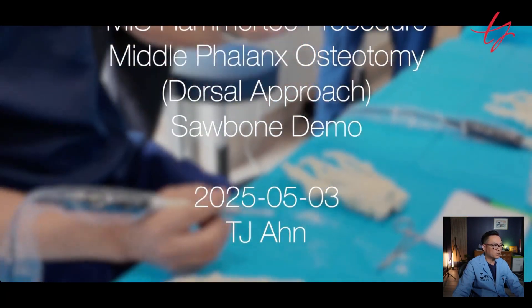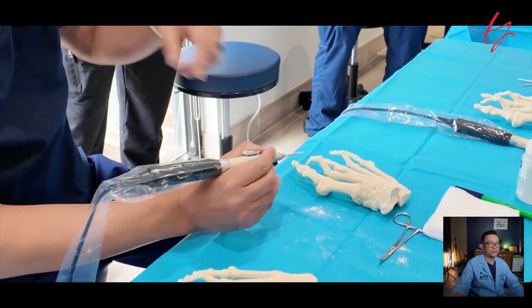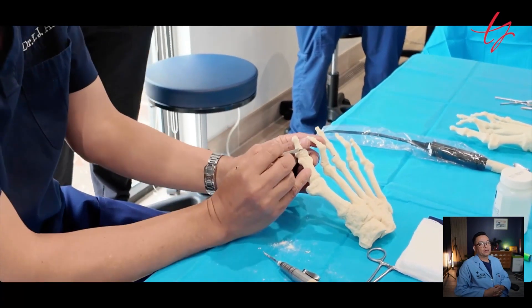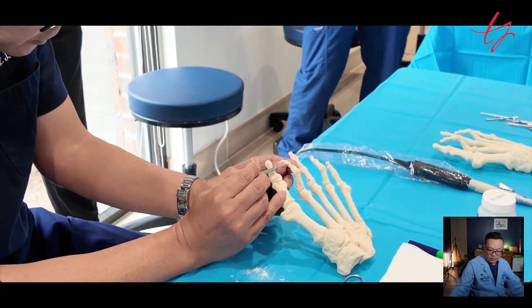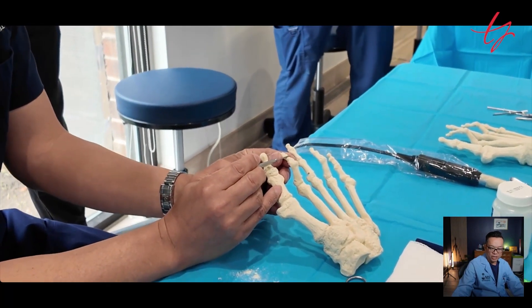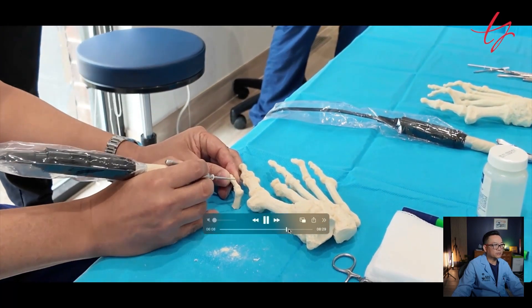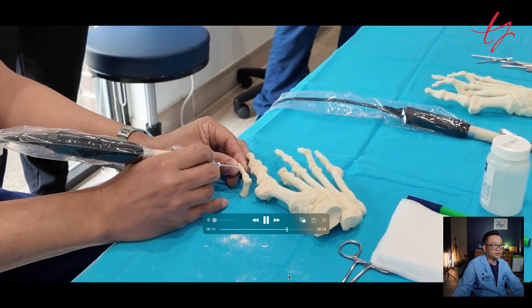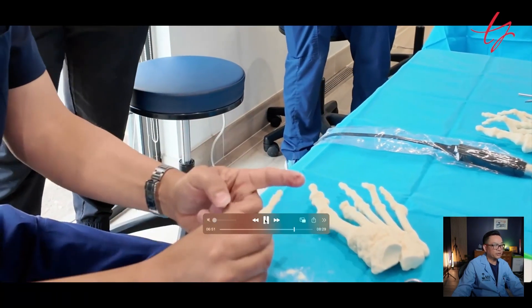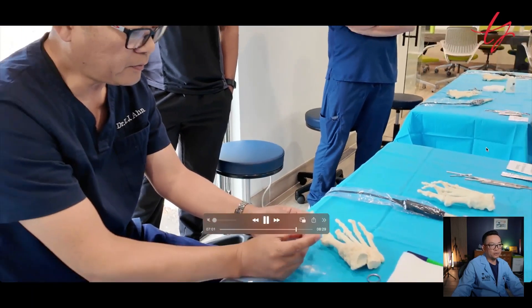After that, this is the middle phalanx osteotomy — a dorsiflexory wedge osteotomy, coming from top to bottom. You follow the same principle: incision at the right portal, create a portal with an elevator, rasp the top of the bone to help the MIS drill engage better, and then go from top to bottom. You can see from my demonstration on sawbone — that's the essence of what's happening in the MIS hammertoe procedure in sawbone format.